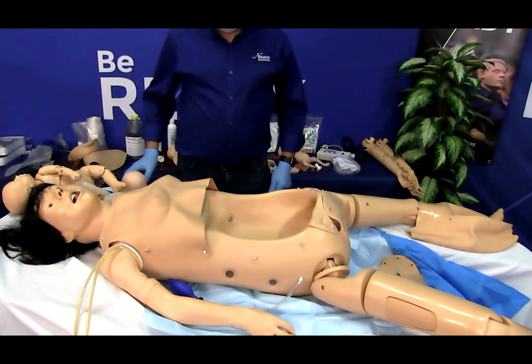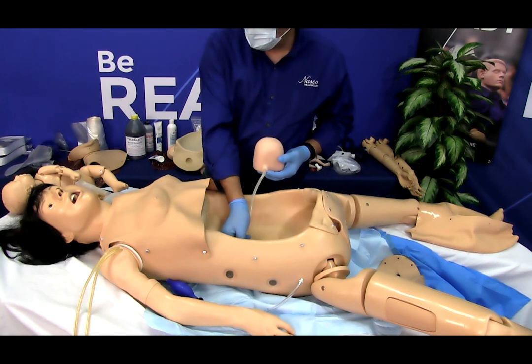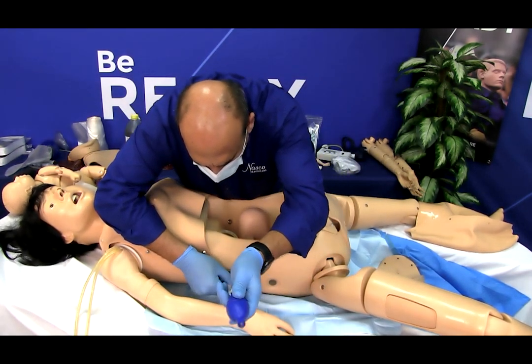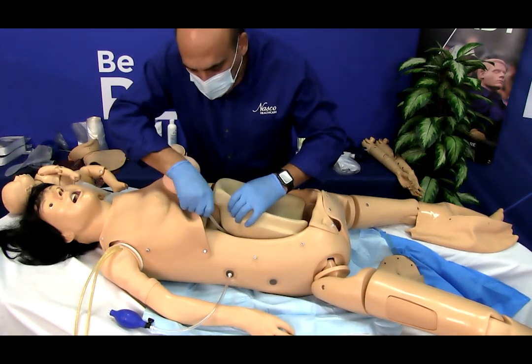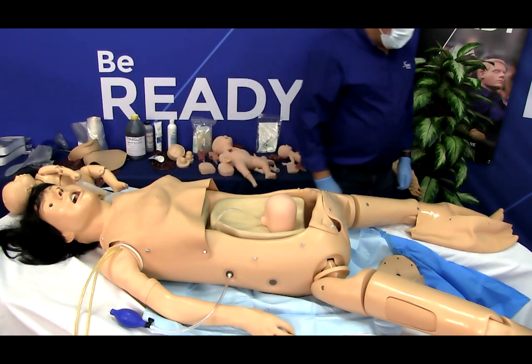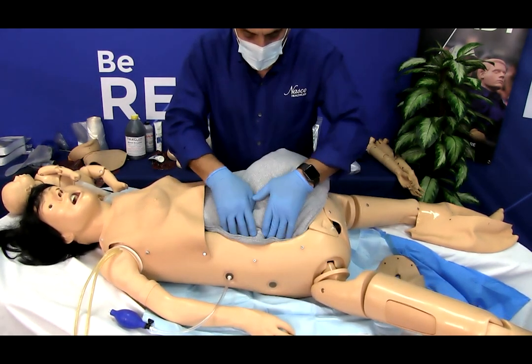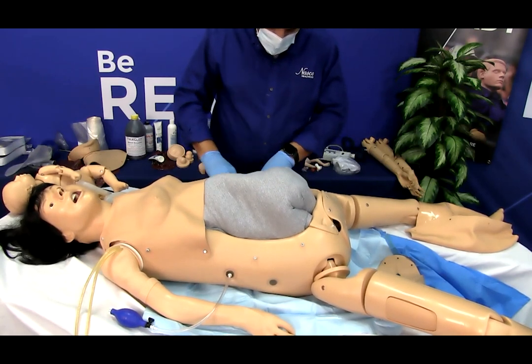For postpartum care, fundal assessment and massage, attach the fundus tubing to the upper side port and attach the inflation tubing with squeeze bulb to the outer port. Place the pelvic block into the torso. Lay the abdominal pad over the abdomen with the tapered end toward the chest. Tuck the rest of the pad loosely into the pelvis around the block. Attach the normal abdominal skin onto the torso and the inflation tubing to the port on the outside.